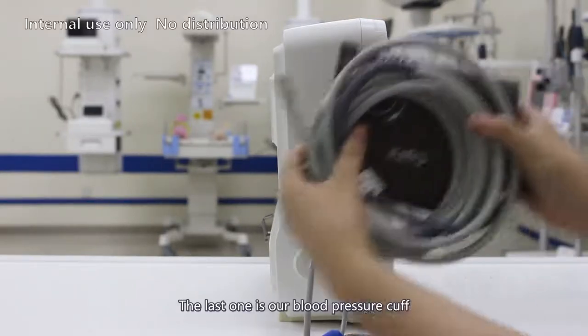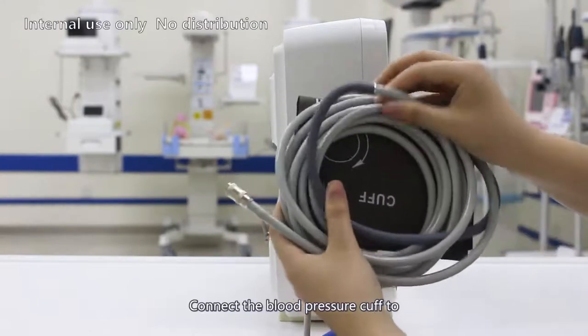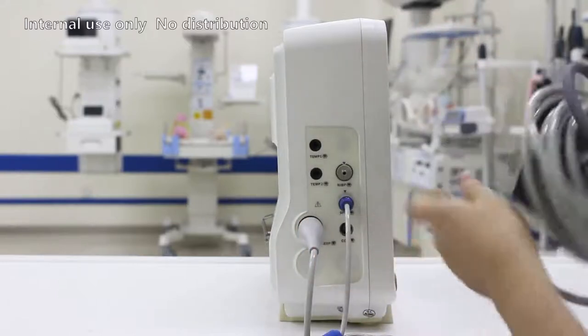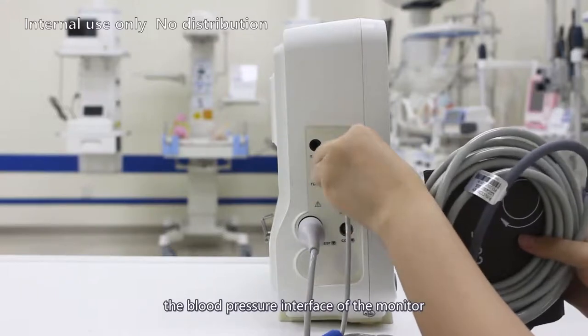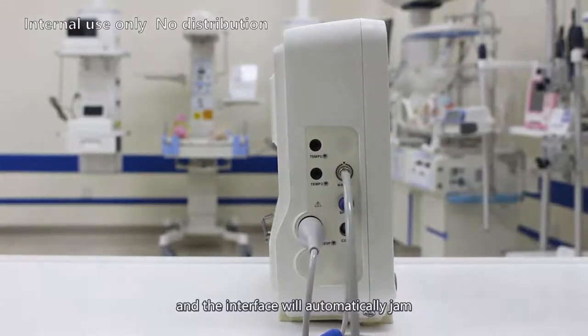The last one is our blood pressure cuff. Connect the blood pressure cuff to the blood pressure extension tube, and the extension tube is connected to the blood pressure interface of the monitor. And the interface will automatically lock.